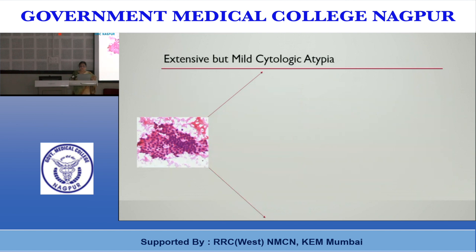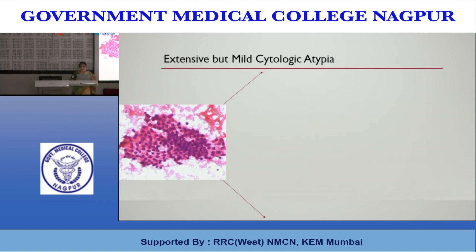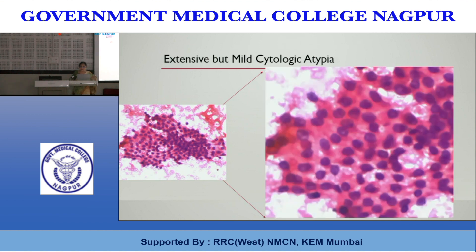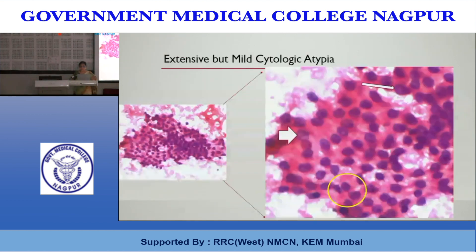A sheet of cells in a honeycomb pattern with mild nuclear atypia in most cells comes under extensive but mild cytologic atypia. There can be pale-looking nuclei with doubtful pseudoinclusions and grooves that are not convincing — this lesion merits inclusion in the AUS category.